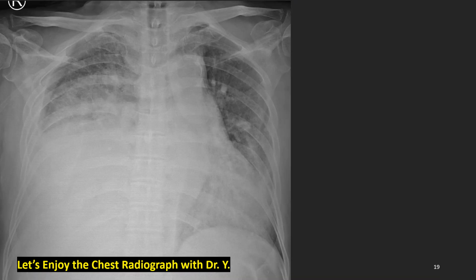How about this patient? This is not an erect film. This is a portable supine film. His condition is not good enough to take an erect film, I think. Almost total haziness on the right side. Probably this is pleural effusion, and mediastinal shifting to the left side. And the right bronchus intermedius is not clear here. Maybe a large mass here with pleural effusion.